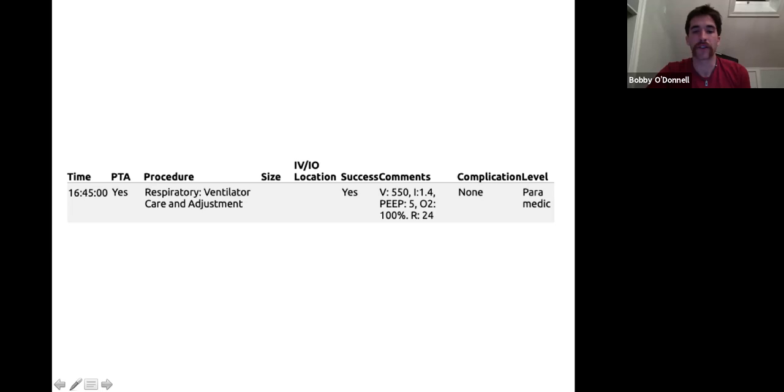Yeah, I think the vent transfer sheets that we have should tick most of the boxes. Sometimes people don't do them, but if you write that out and then scan that in, we can pull that off of CQI, and that will, at the least, give us our vent settings, which I'm curious about. And the pharmacology side of it, you would have documented like you normally would in your report. So we'll see that just fine.